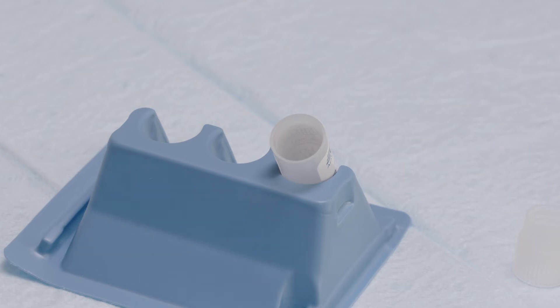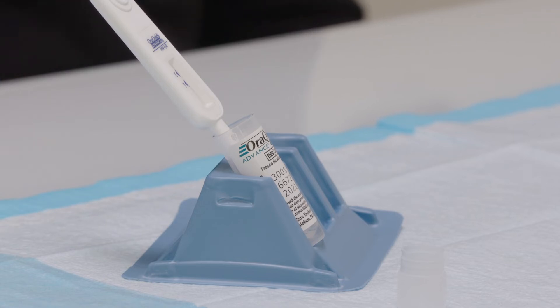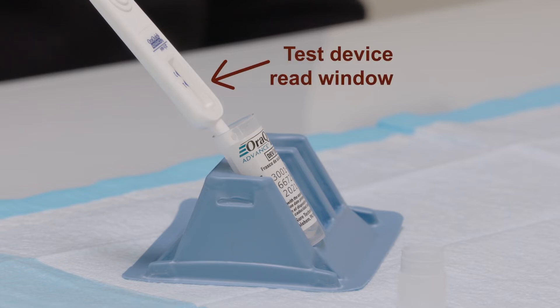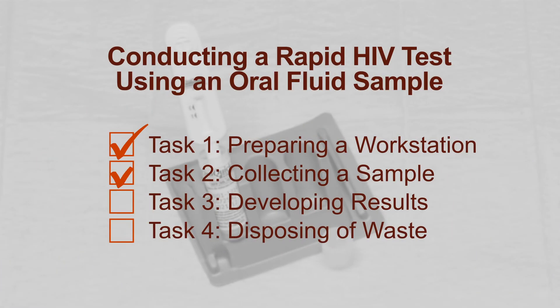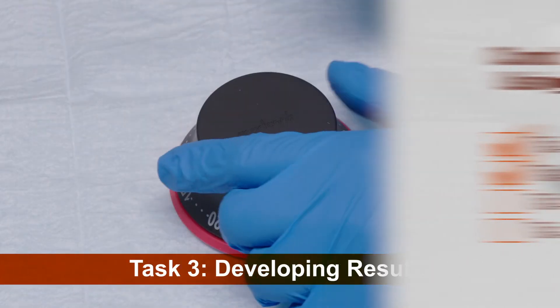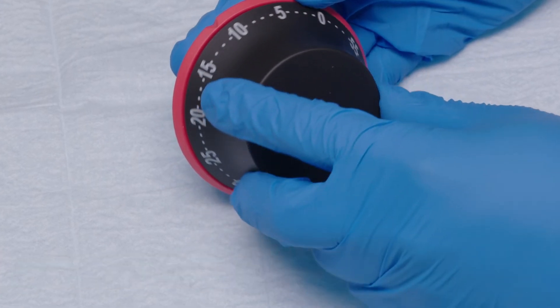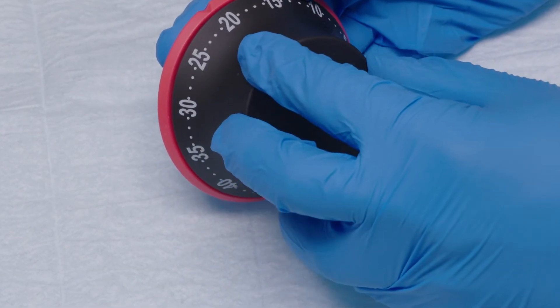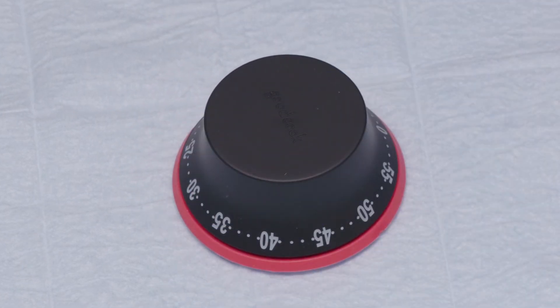Once the client has collected the sample with the flat pad, instruct them to place the test device into the developer solution, making sure the pad touches the bottom of the container. The read window on the test device should face out when in the vial so that it can be easily seen and read. Now start a timer for developing the test. Refer to the test instructions for information on how long test development takes for the brand you are using. For this test, set the timer for 20 minutes.